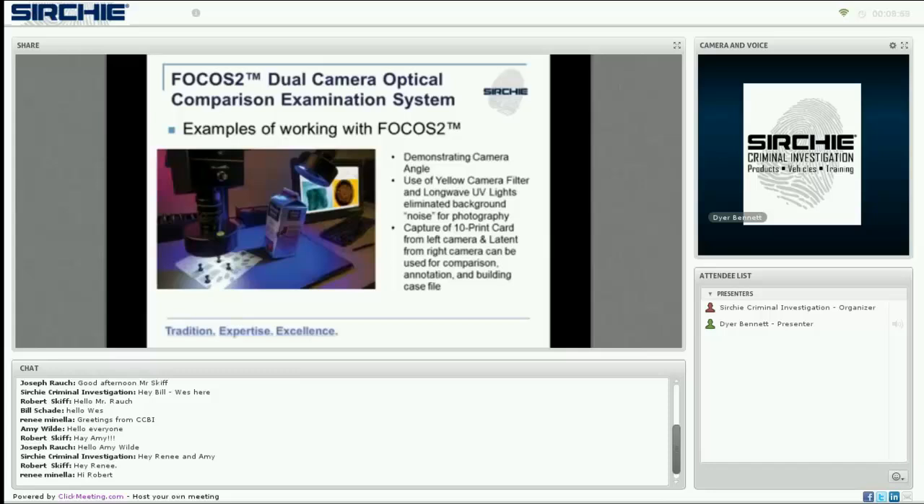In this example, we're demonstrating the flexibility of the cameras. The right camera is tilted at an angle to align with the cap of a juice carton that has been fumed, and a latent print was identified on the cap. The best image resulted from using an orange filter with 455-nanometer blue lights, as represented in the monitor feed on the right-hand side.